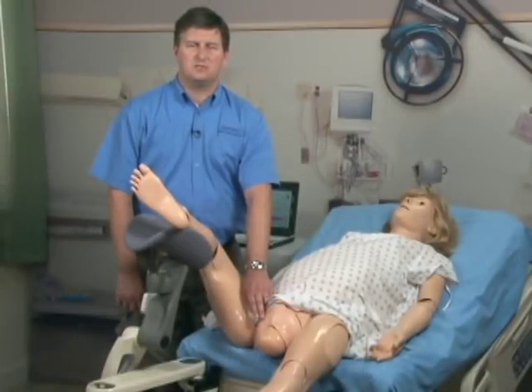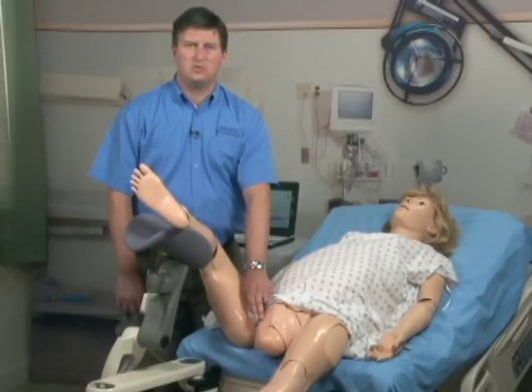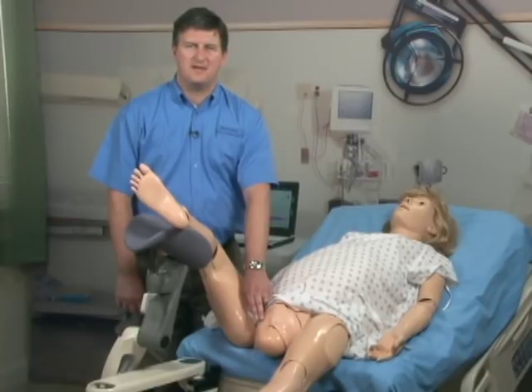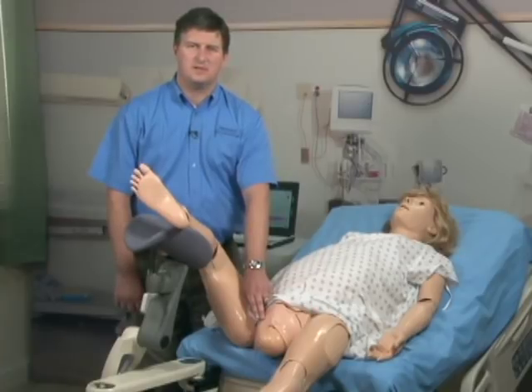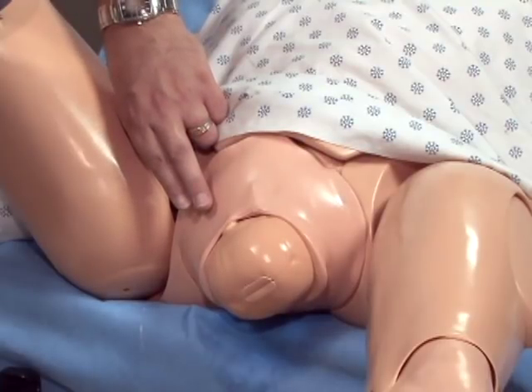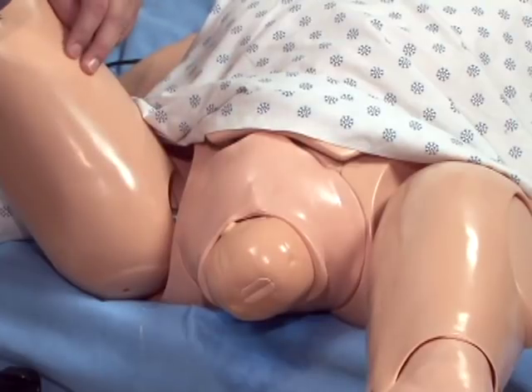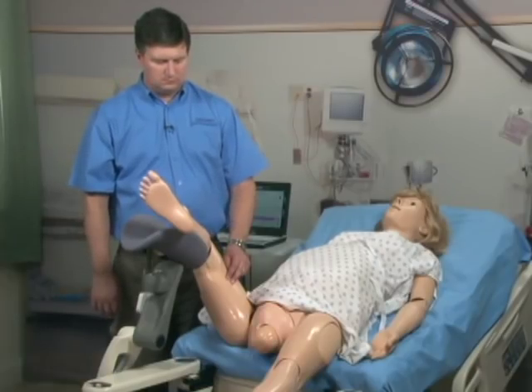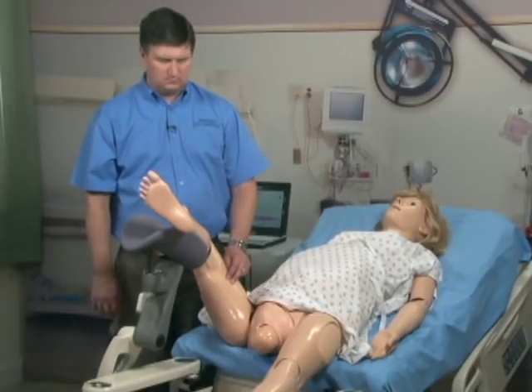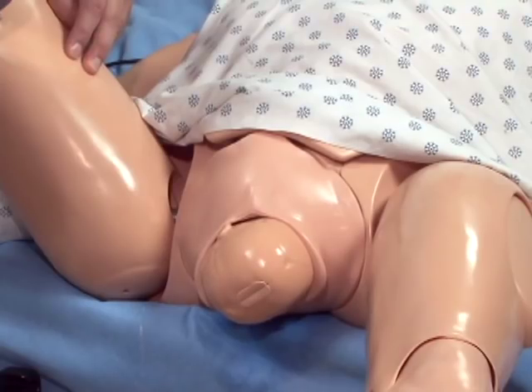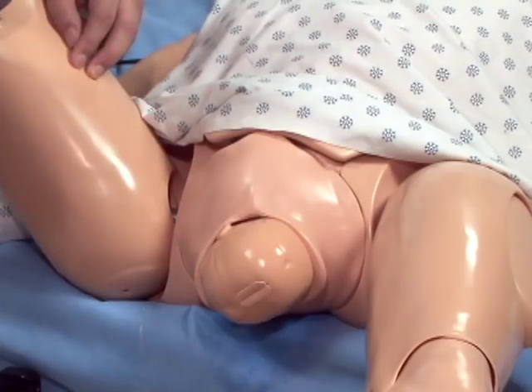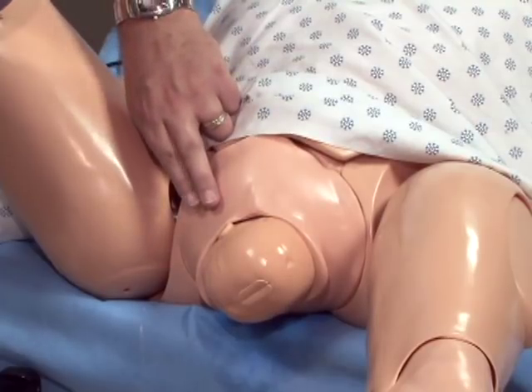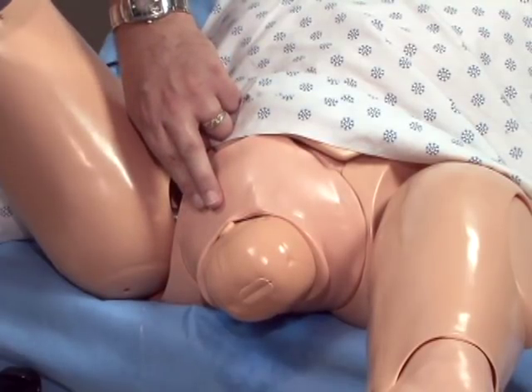During a dystocia emergency, as the baby becomes stuck, the head will inch forward with each contraction. Then as the contraction subsides, the baby will inch back towards the perineum, thus displaying the classic turtle sign. The head begins to inch forward as the contraction peaks. As the contraction subsides, we see it inching back towards the perineum.